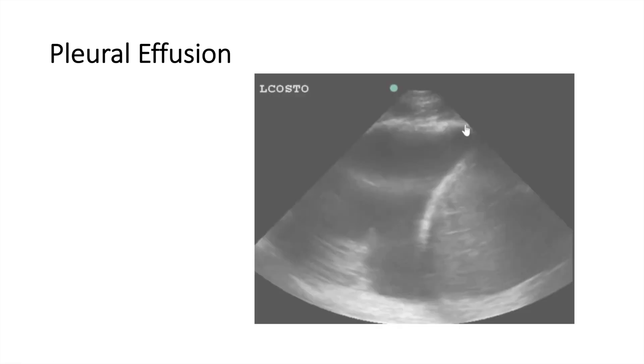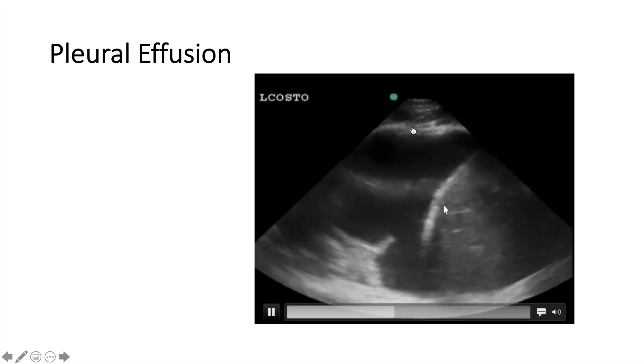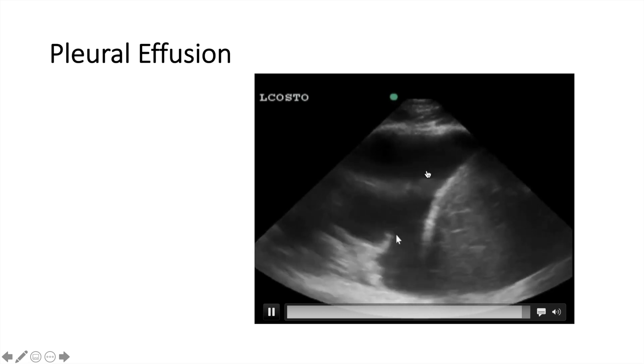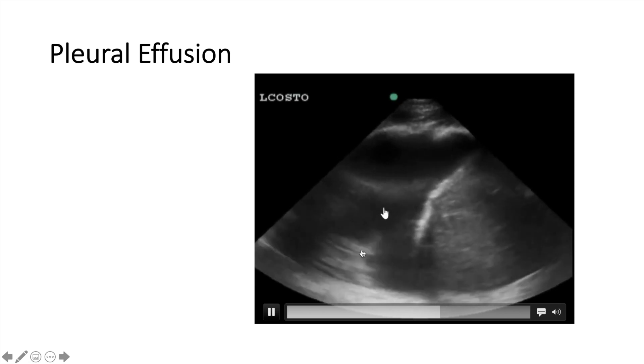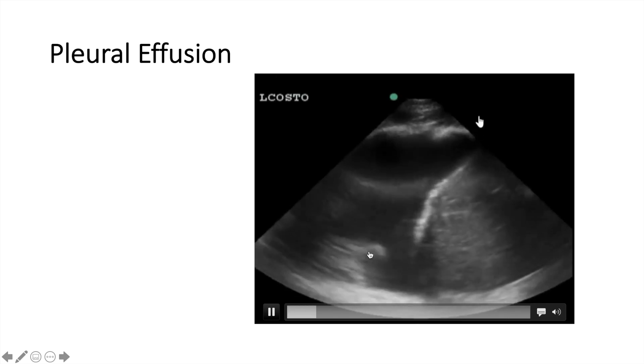Pleural effusion is easily detected using ultrasound. This is a large effusion — you can see it above the liver. This is the liver, and the black area here is the effusion. There is some debris in the effusion, and this is what it looks like — a jellyfish. This is what's called the jellyfish sign.